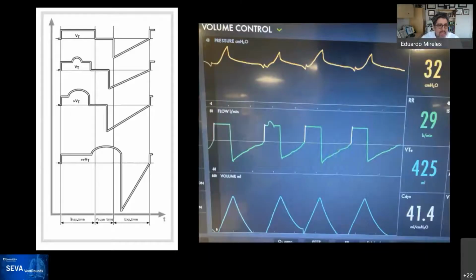And this was highlighted on this table. Don't look at this one for now, but just look at this one over here. You can see here the I time, and how the I time shortens, right? When there's more Pmus, and then when the Pmus is even larger, it shortens the I time. But if you start at the end and it's very large, it will cycle by the patient.